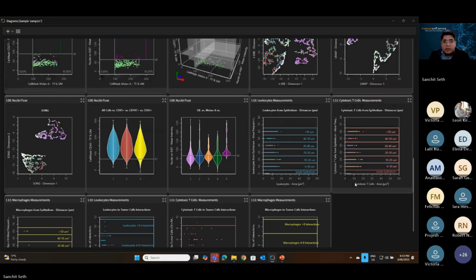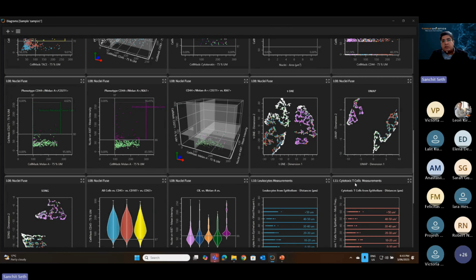So StrataQuest provides you with the tools to analyze innovative new research questions, as well as the flexibility to interpret those results if any manual corrections are required, as well as the tools on how to summarize your data.